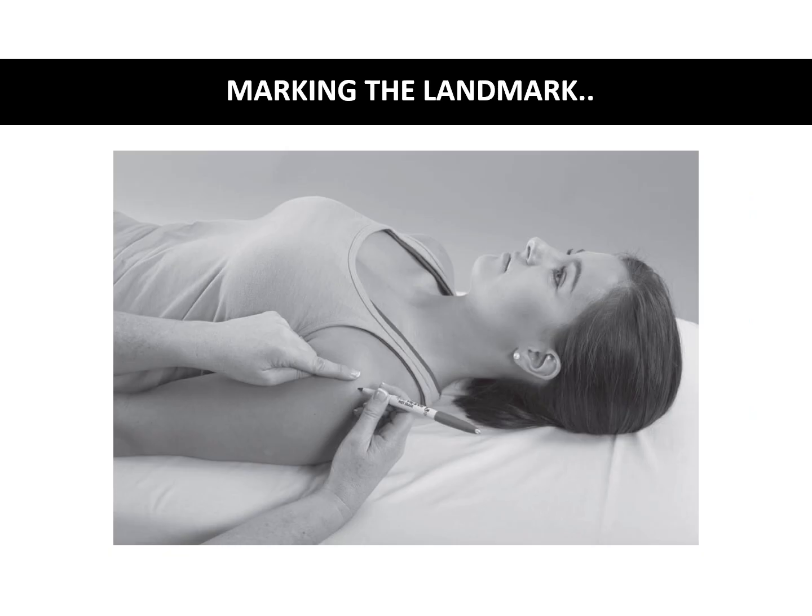So in this figure, you can see that the therapist is looking and palpating for the bony landmark where the motion takes place of a particular joint. So this is the shoulder joint. The therapist is palpating for the bony landmark, and you can see that he is trying to mark the particular landmark, because if you mark it, you are sure that this is the landmark and I have to place my axis of the goniometer at this landmark only. So you will not deviate and your readings will be much better. It will be much more accurate and reliable.